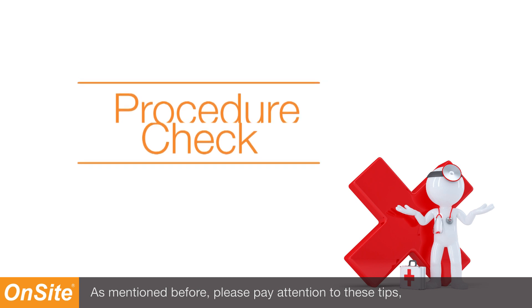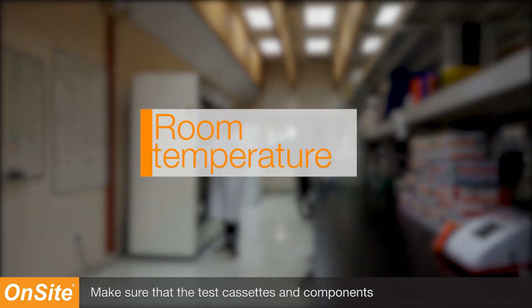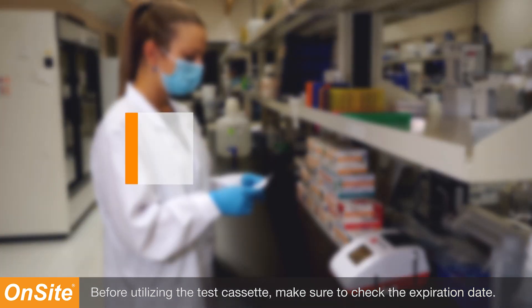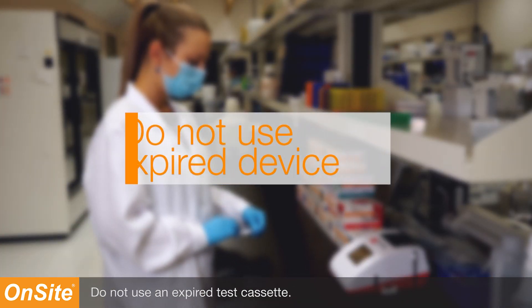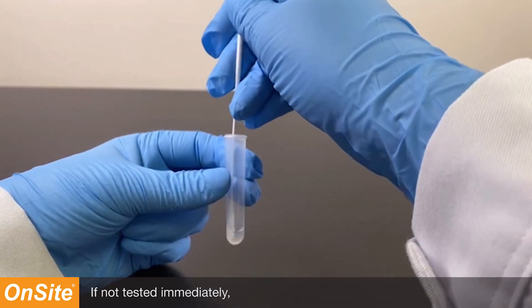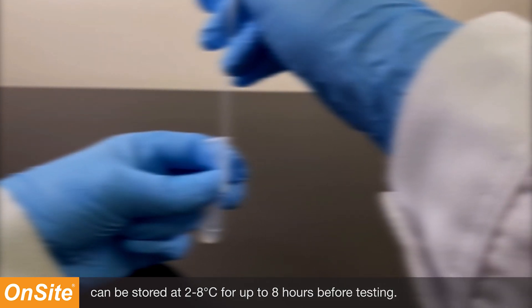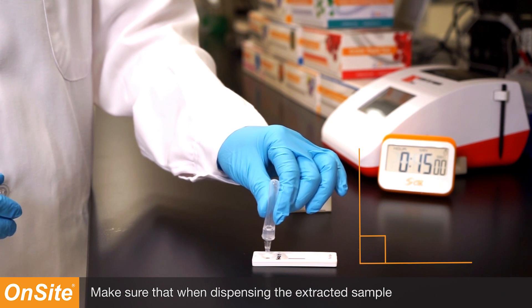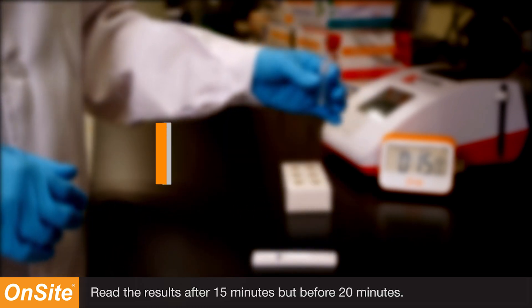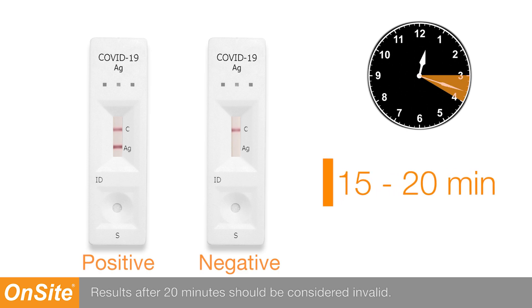Please pay attention to these tips to ensure proper procedure. Make sure the test cassettes and components are at room temperature prior to testing. Check the expiration date and do not use an expired test cassette. Test samples as soon as possible after collecting. If not tested immediately, specimens extracted from the swab can be stored at 2 to 8 degrees Celsius for up to 8 hours before testing. Make sure that when dispensing the extracted sample the tube is held vertically, and do not overload the sample well. Read the results after 15 minutes but before 20 minutes; results after 20 minutes should be considered invalid.